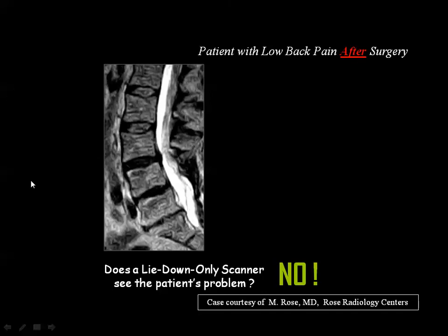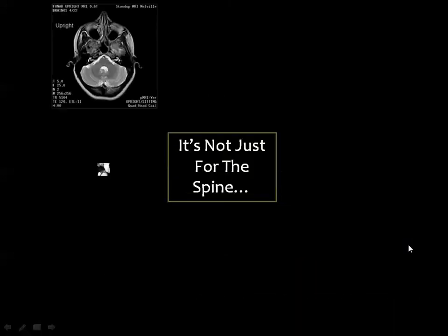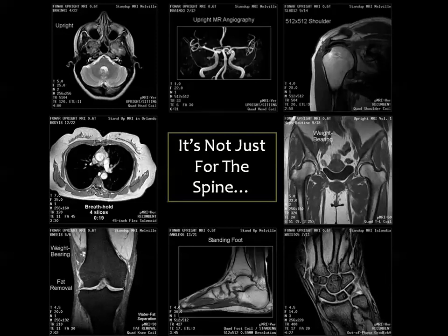And this is just an example. This patient had an operation at the lower part of his back, and he is still complaining after surgery, but the supine MRI showed that the site of surgery is good, there is no complications at all. Then, after examining the patient while he is standing, meaning that he is doing an axial load on the spine, there is a major instability at this level, L3-4, and there is marked narrowing of the spinal canal at this level, and this is the cause of the patient's pain. And this machine was only introduced for examination of the spine, but now it can examine all parts of the human body, the shoulder, the hip, the wrist, anywhere.